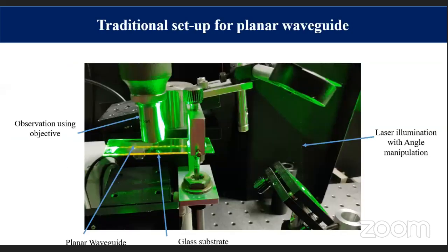So I thought, why not make it more compact. And then in the laboratory I made this setup where this laser has been manipulated in a particular way. There's a prism here which I've used and generated a waveguide. You can see that the clean waveguide has been generated, which is zigzag light which is coming in and out, and emerging out from here.